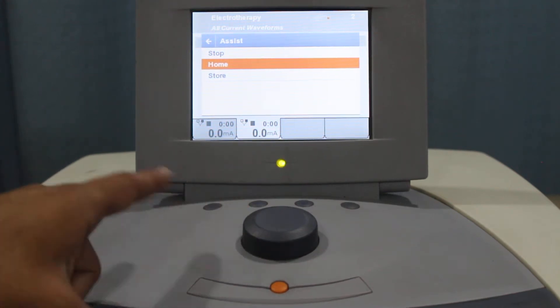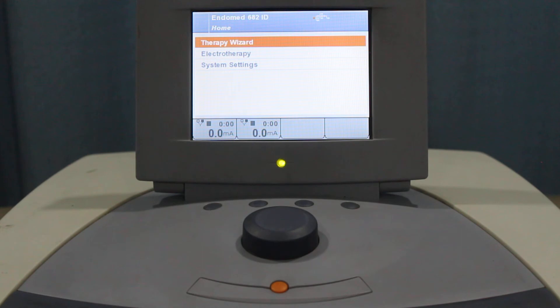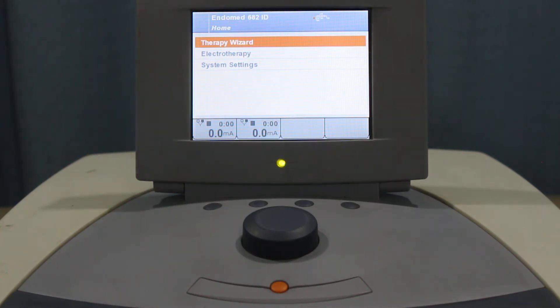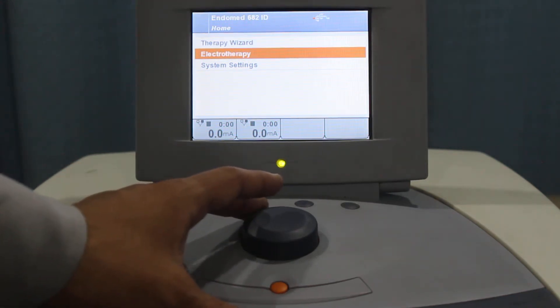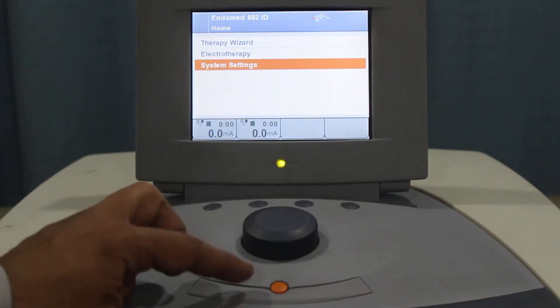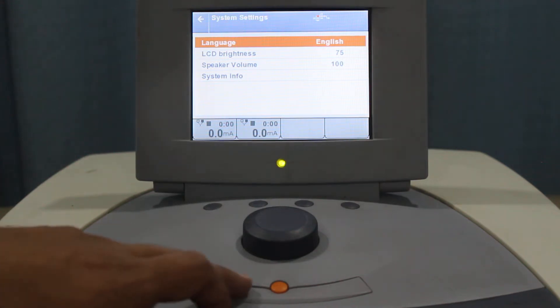We can click to the home and it will take us to the home main menu. Now there are three options available: one is called the Therapy Wizard on top, the second is called Electrotherapy, and then System Settings.